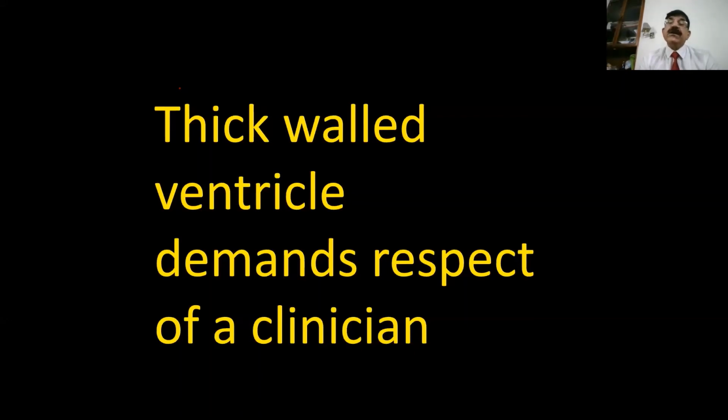Here what is happening is, because the left ventricle continues to relax in mid diastole, the LA pressure has to be high to push the blood into the left ventricle. The left atrial pressure disproportionately rises to compensate for that incomplete relaxation. Because of that, you see this triphasic flow. Triphasic flow is typical of diastolic dysfunction, but it is more often seen in other conditions, non-hypertrophic cardiomyopathy, when there is a relative bradycardia. However, in hypertrophic cardiomyopathy, regardless of heart rate, you would see the triphasic flow.